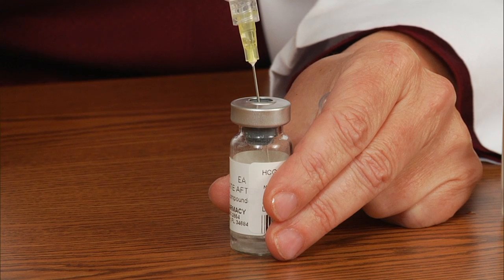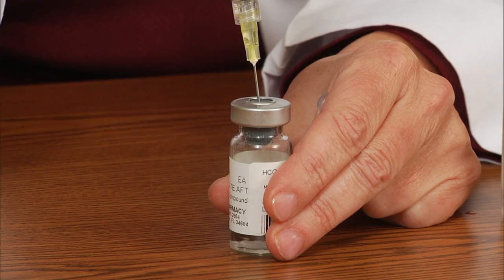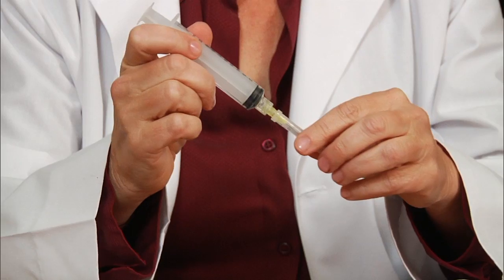Now put the needle through the lid of the HCG and slowly inject the bacteriostatic water along the side of the vial, then remove the needle. Gently swirl the powder with the water — you don't want to shake it. Now you're ready to prepare your dose.